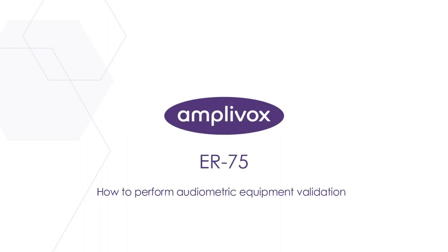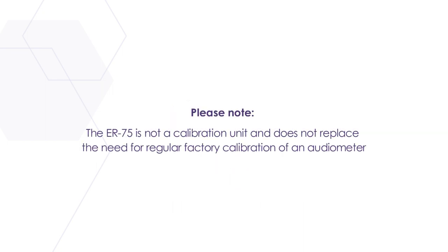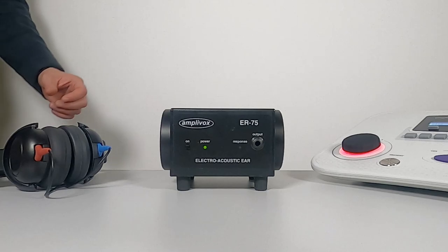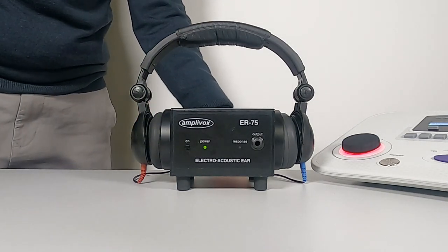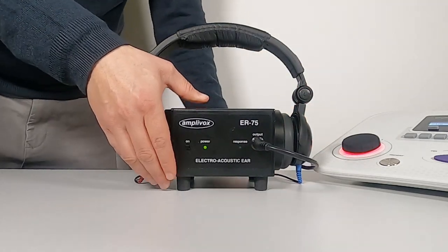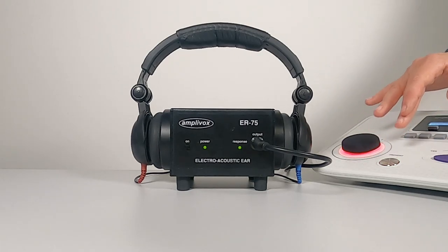Welcome to this video on the ER75, which explains how to perform audiometric equipment validation. The ER75 is an electroacoustic validation tool that allows the user to get an objective confirmation that their headphones and audiometer are performing correctly. This brings confidence and peace of mind when working clinically, as users know their equipment is delivering accurate signals. The ER75 performs a validation of the pure tone air conduction output of an audiometer.